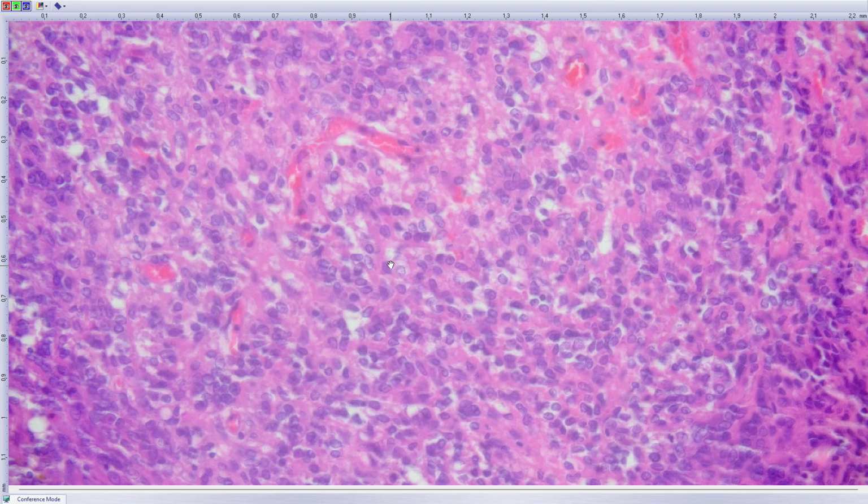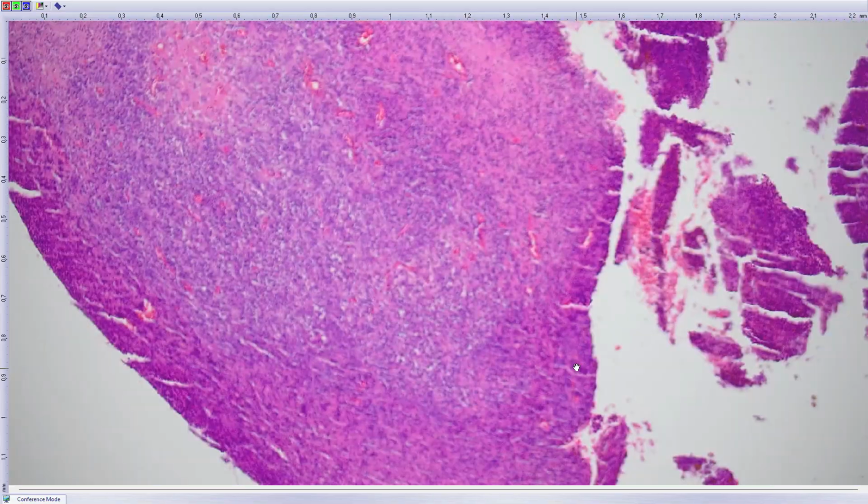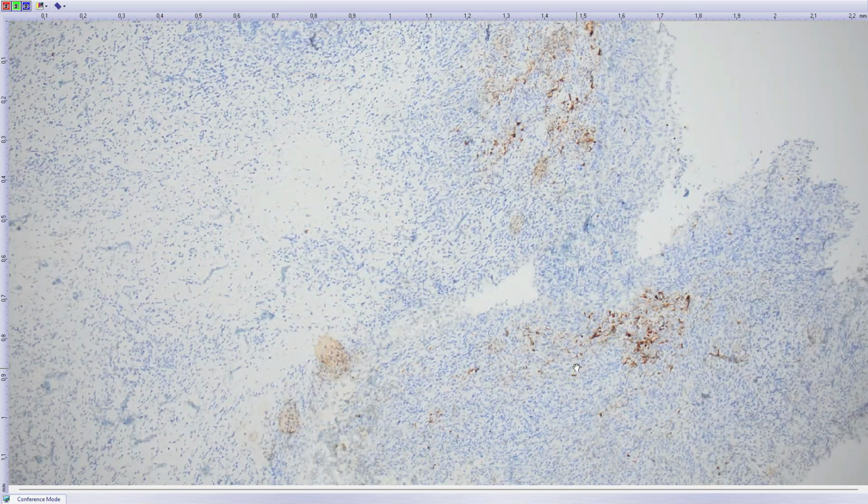This tumor has, at least for me, very characteristic cytology. It's the so-called histiocytoid appearance of the cells. And when you look at the nuclei, they have pale staining chromatin. It's always present in these tumors. So, angiomatoid fibrous histiocytoma. Again, there's no magic immunostain for it, but there is a combination of stains that tend to be positive. One of them is desmin, which I think had some expression. It's usually focal to patchy, so here we have some focal expression.